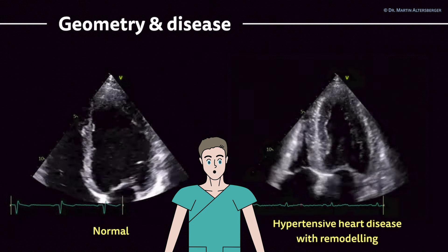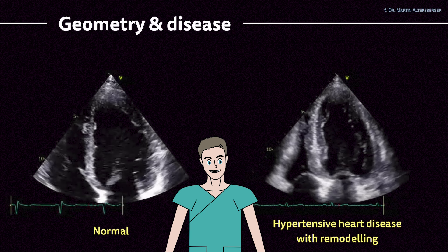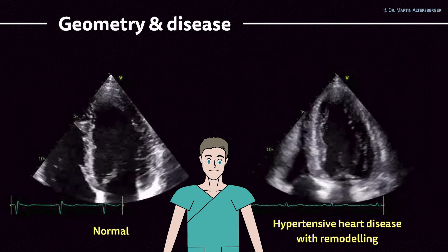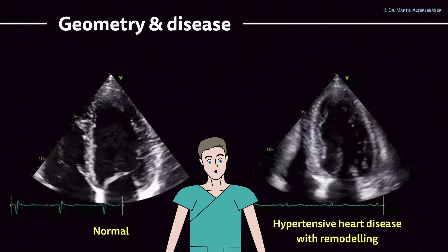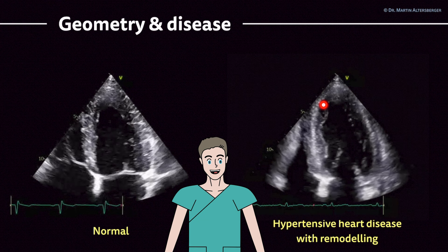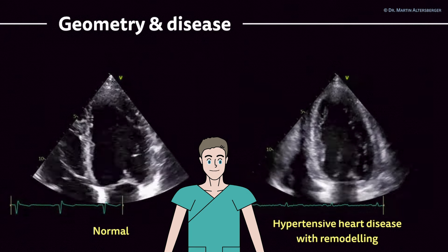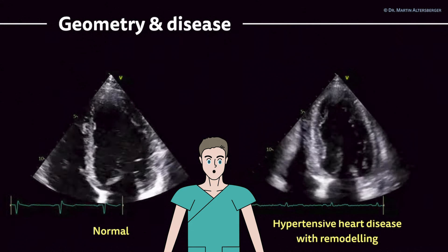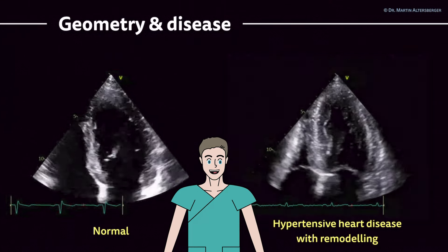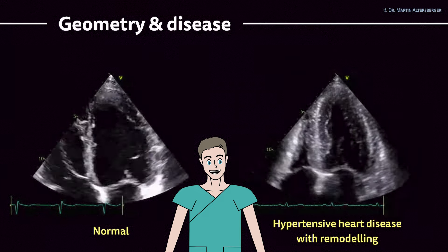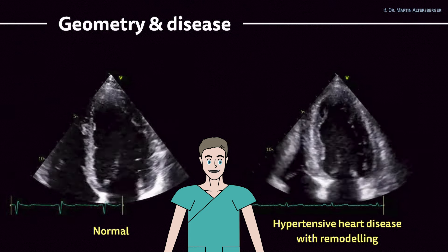Moving forward, we have another example comparing a normal heart with a pathological one. Here the walls of the left ventricle are thickened — this is a patient with severe hypertensive heart disease and remodeling. A remodeled left ventricle means fibrosis is present. The cavity of the left ventricle is smaller compared to the normal variant, and ejection fraction is around 50 percent. Even though ejection fraction appears normal, this heart is definitely not normal — the left ventricle shows damage from long-standing severe hypertension.